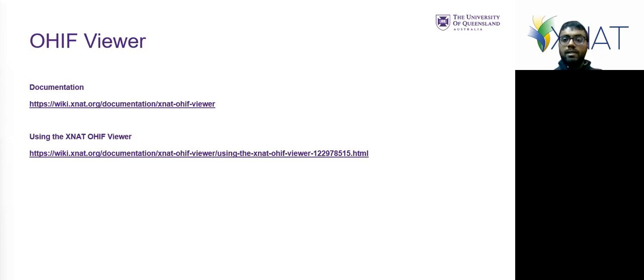So do you recommend we use XNAT as a long-term data repository or as a transfer system? This is a bit tricky. So it has a couple of caveats. So for first thing, this is the UQ AIS XNAT. So for UQ users, we would recommend this as the long-term data repository, and for imaging data to be in XNAT. So that's where we'd advise to go.